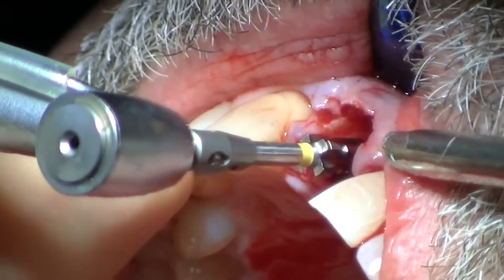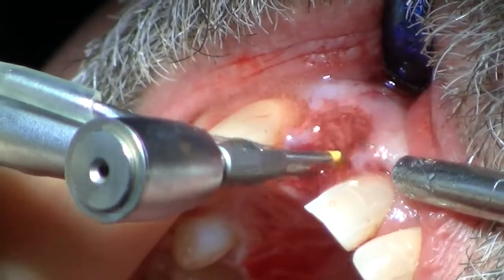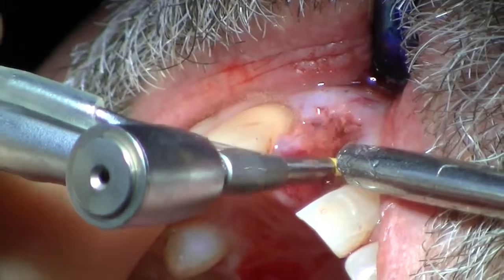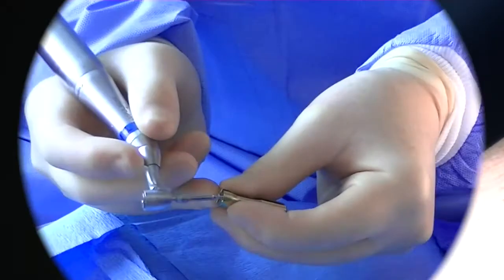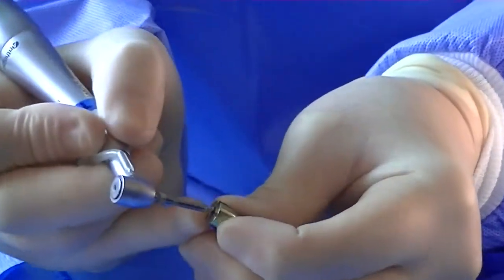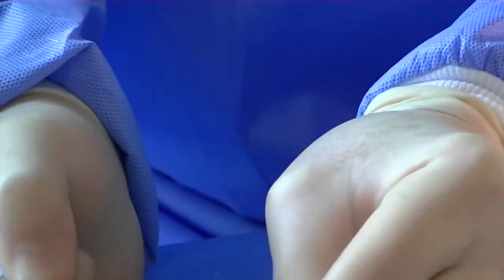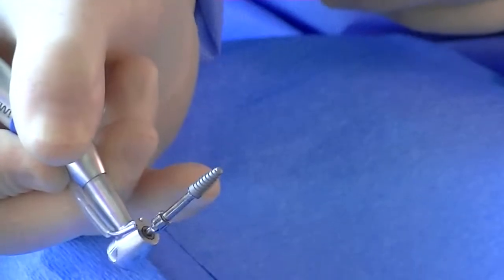And this will be a nice shape of the final position. Again, you would take radiographs throughout this process. And again, same procedure. We're going to engage, open the clothespin, and check to see the rotation.